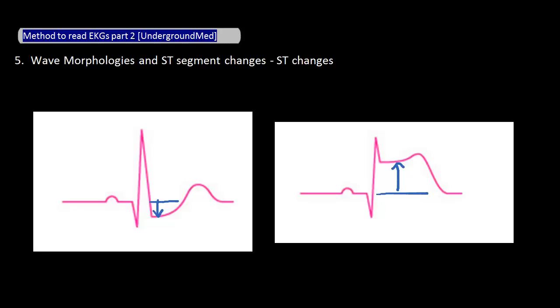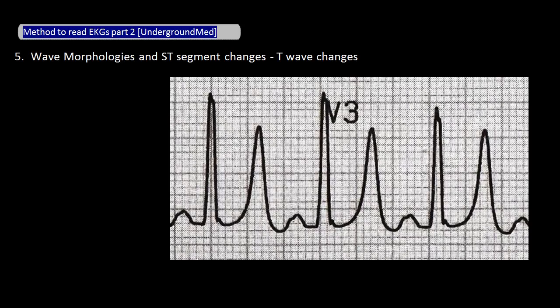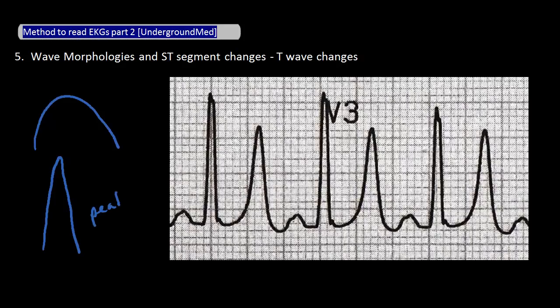When you are reading an EKG in real life, it's very important to look for ST changes in all 12 leads. You may also see peaked T waves, which are associated with hyperkalemia. Large T waves are not the same as peaked T waves. When thinking about the difference between large and peaked T waves, I like to ask myself if it would hurt my butt to sit on the T wave. If it's round and smooth, it wouldn't hurt. But if it's pointy, it would hurt my butt — and thus, this is a peaked T wave. In this EKG, do you think these T waves are large T waves or peaked T waves? If you said peaked T waves, you are correct.